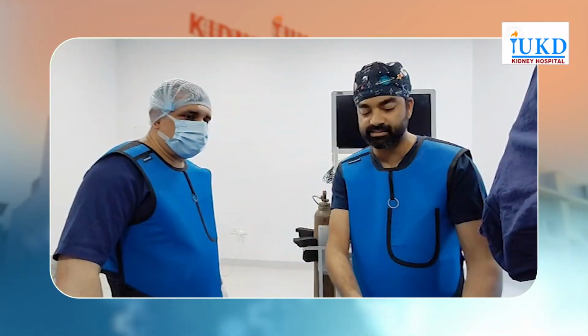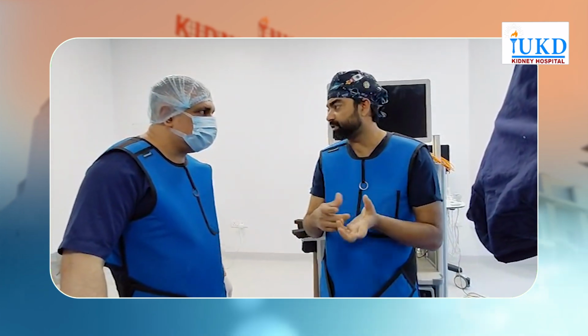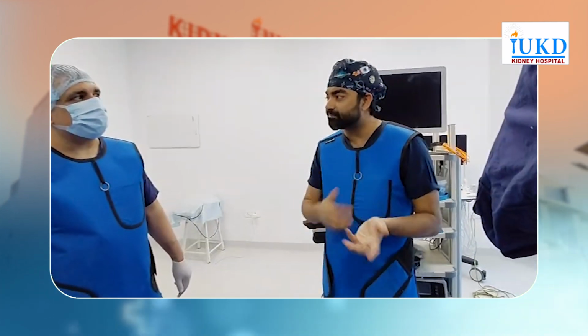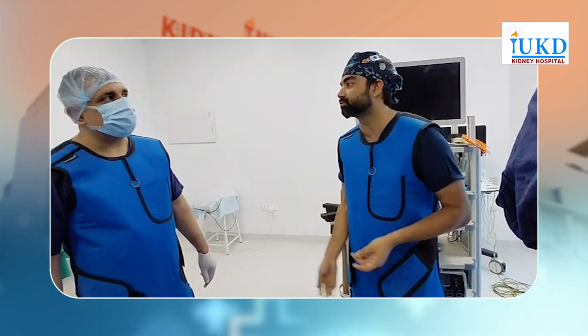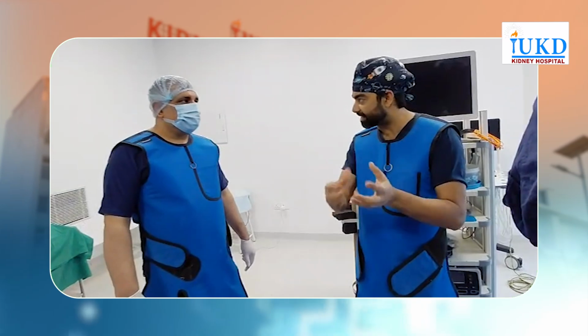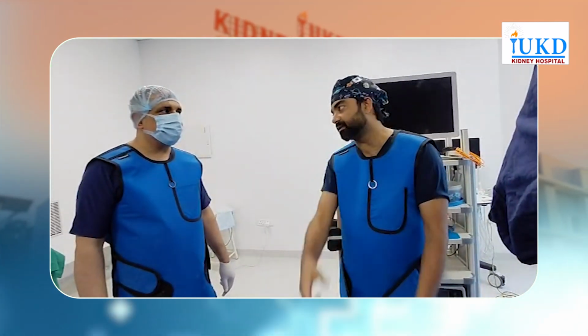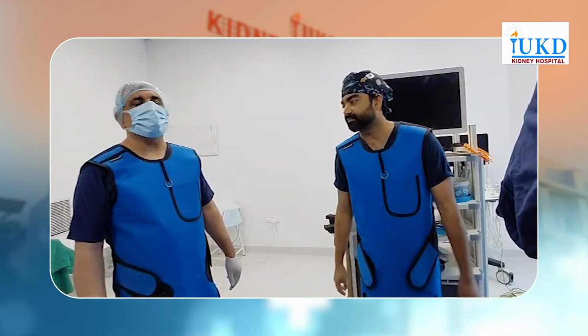So what I do generally is I feel the stone and then I try to put the guide wire there. If I cannot do that, I push some water. Most of the time we dilate without the guide wire going into the ureter or even the pelvis itself. So it just coils there. I know that I'm at the stone. I dilate till where my stone is, and then I see in the nephroscope and adjust. That's how I do it.